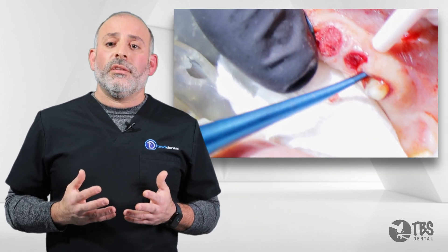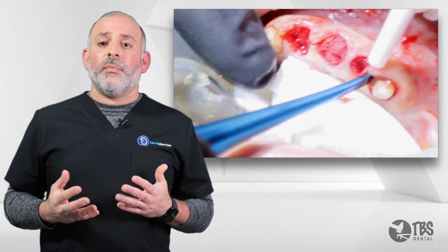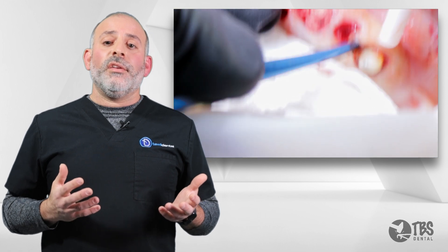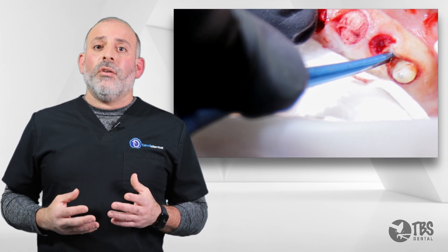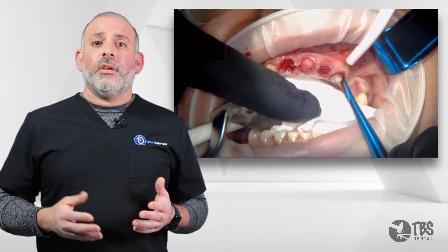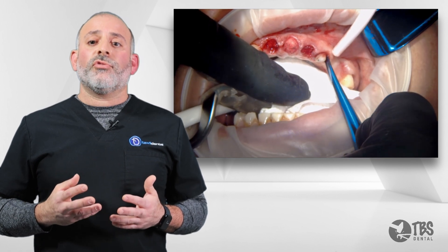This tooth happens to be root canaled — it's endodontically treated. It's most likely ankylotic, meaning it's fused to the bone itself. So this should be quite a difficult extraction and should take a very long time. Often, clinicians may pick up piezo instruments, burrs, all different types of instruments to try to extract this tooth.